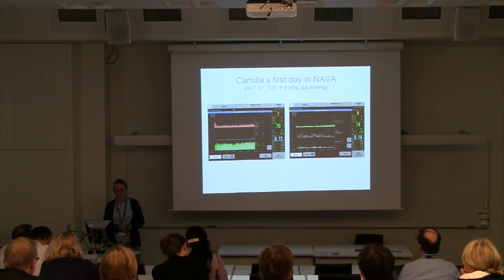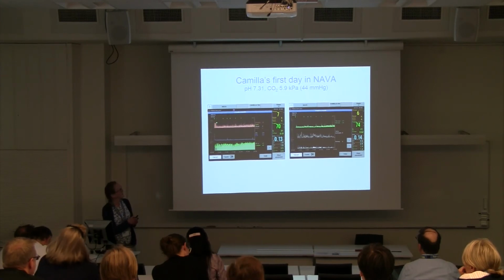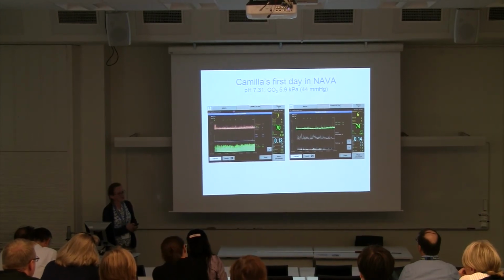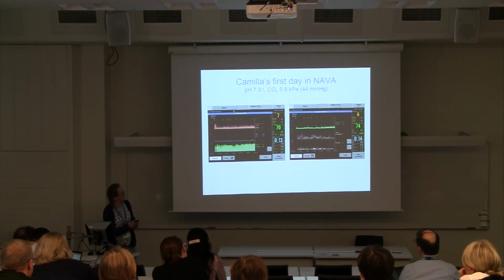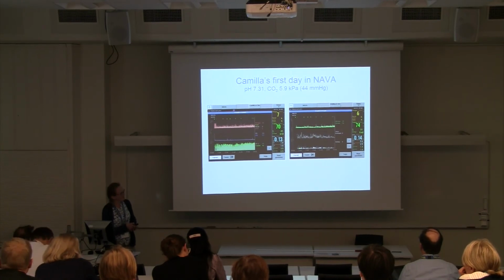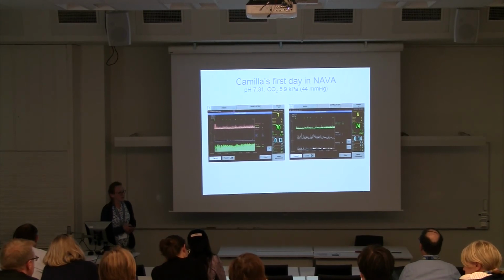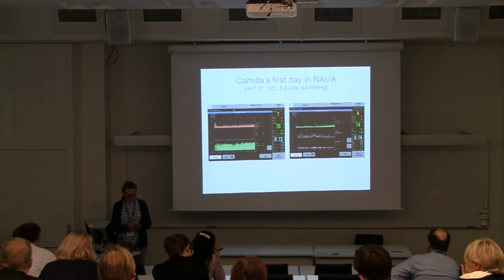So this is Camilla's first day in NAVA ventilation. Here you can still see the very beginning of her being on conventional ventilation, and then quite low pressures used on NAVA ventilation, and a quite stable respiratory rate. Not many apneas per minute, and she didn't spend much time on backup ventilation. Here you can also see her blood gas analysis, which looked very good, and the baby was very stable on NAVA at this moment.